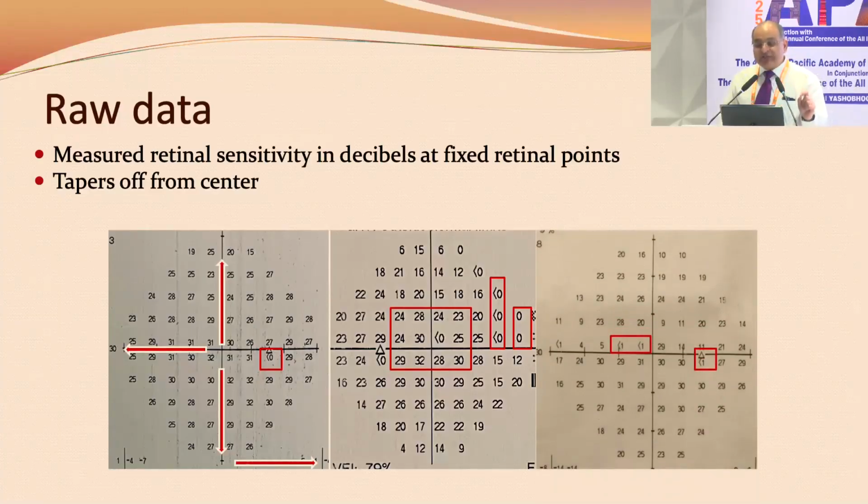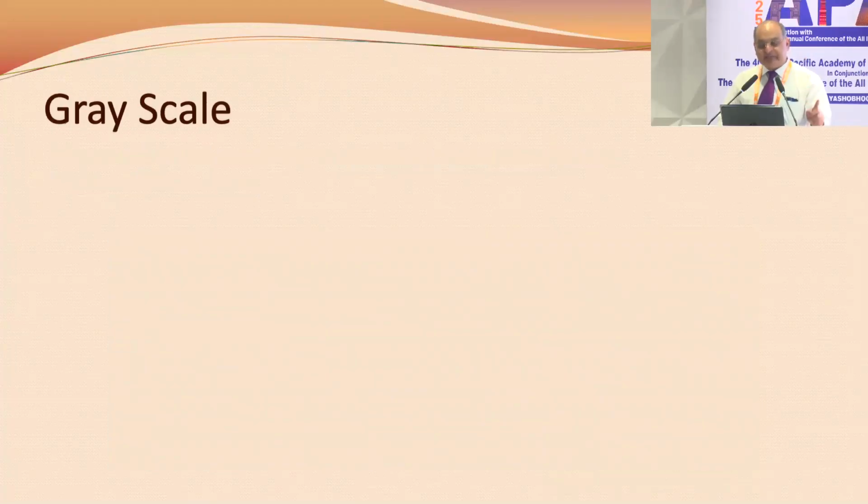Wherever we have values like less than 1, less than 2, less than 3, that means the perimeter is not able to offer the maximum intensity which it should give. That means that the bulb of the perimeter is at fault and it needs a replacement.